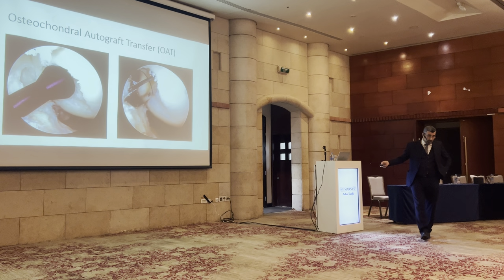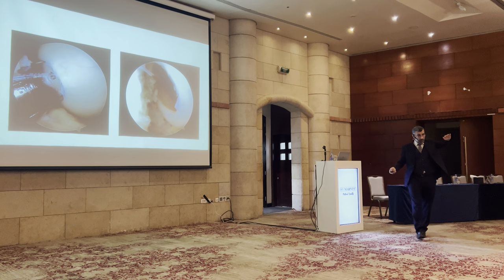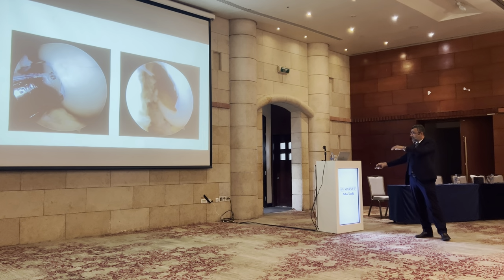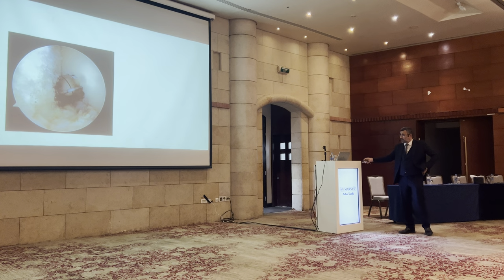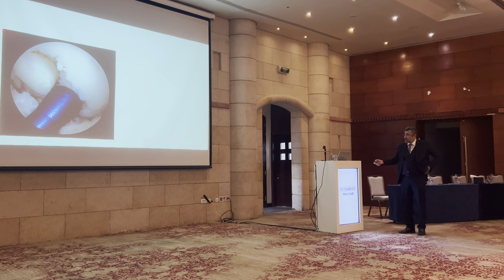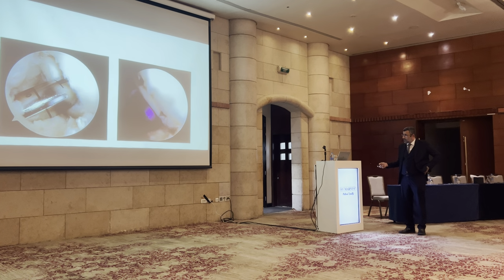I'll go fast through this, how to do the technique. Arthroscopic is, I think, more precise than the open technique because you can see everything and also define the orientation, because the graft is oblique, so you can decide, rotate, and decide which surface matches which side of the articular surface. Here, this is the most critical step in the procedure when you hammer it. And look here, the defect. Look here, this was the bone defect. So we place the cartilage at the bone, measuring, and so on. So go fast.